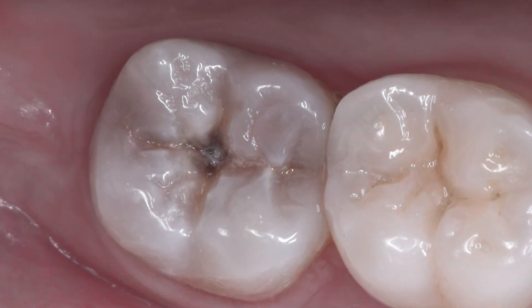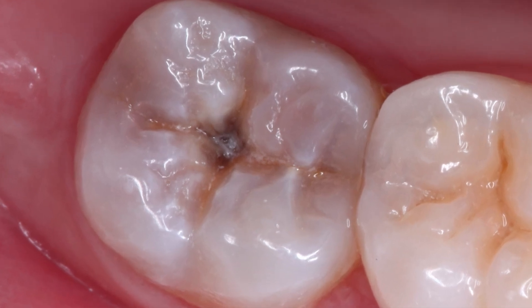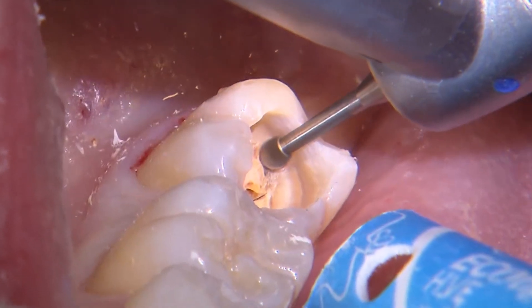Our examination reveals severe occlusal decay on tooth 31. The plan is to perform a caries clean-out and a direct composite restoration.